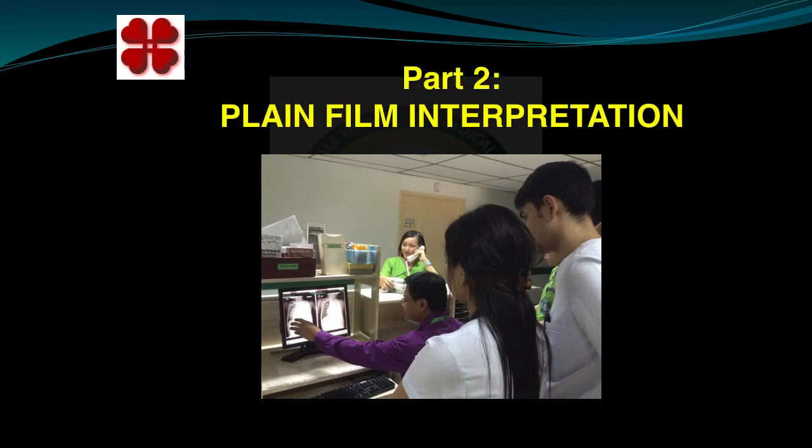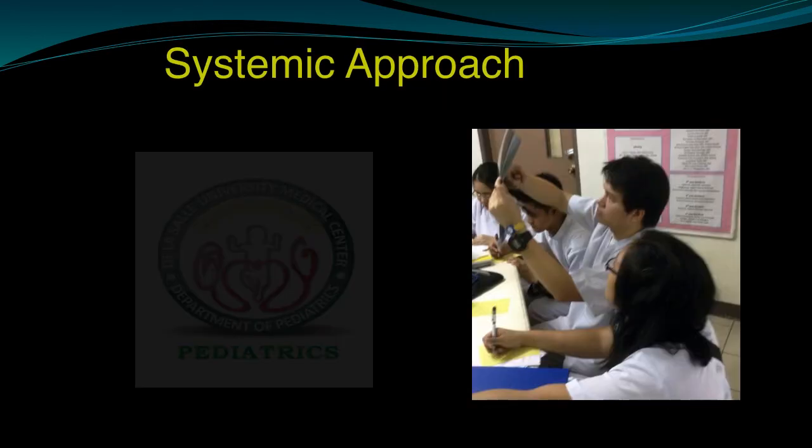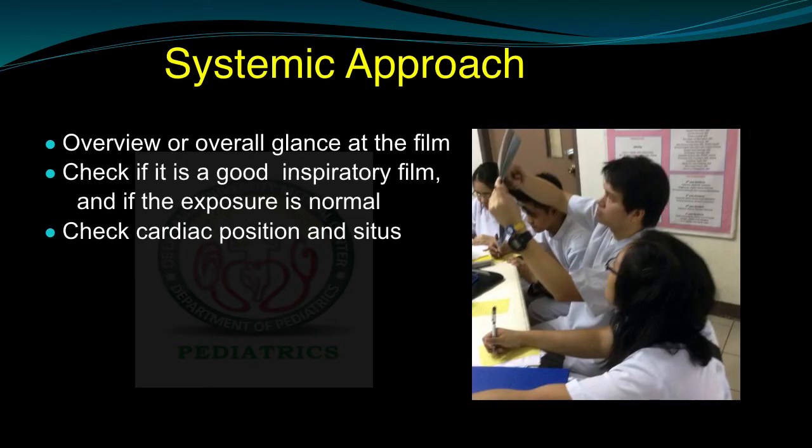Okay, let's go now to the second segment of the lecture, which is now part 2, which is plain film interpretation. When you are interpreting a chest x-ray, you should follow the systematic approach.